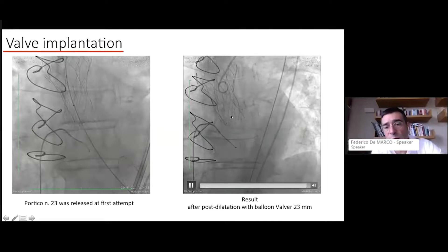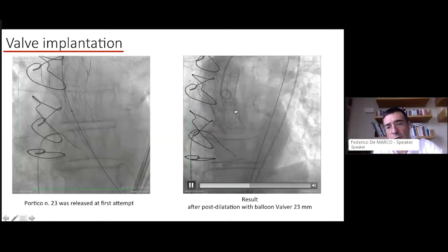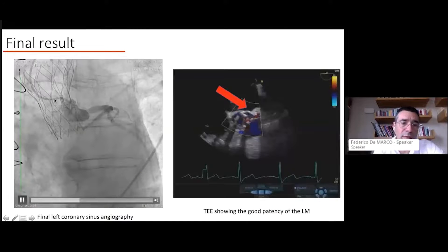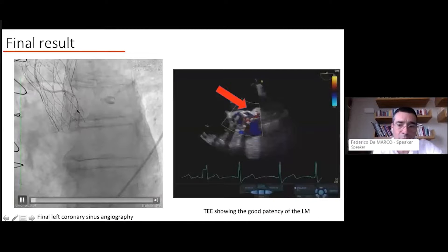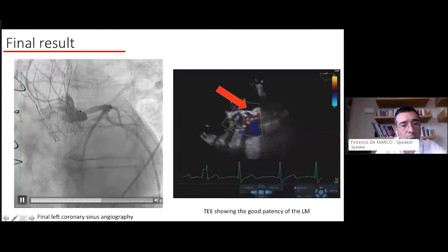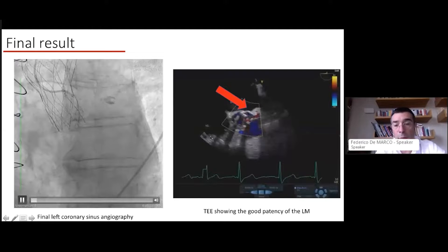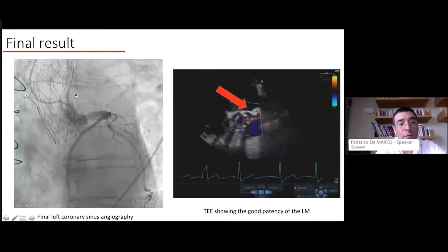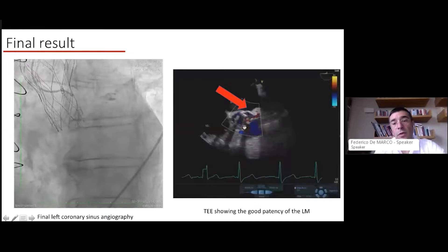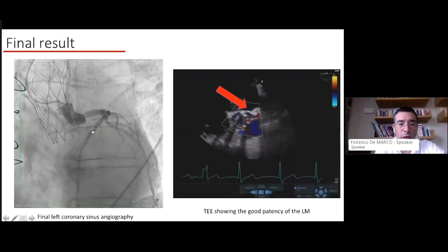You implant the Portico device according to standard valve-in-valve practices. In this case, we post-dilated with a 23mm balloon. The final result is very good — device depth is quite nice. The final angiogram shows some material in front of the sinus, suggesting that without BASILICA there probably would have been sinus sequestration and coronary occlusion. You can confirm patency of the left main either on echo or by angiogram.